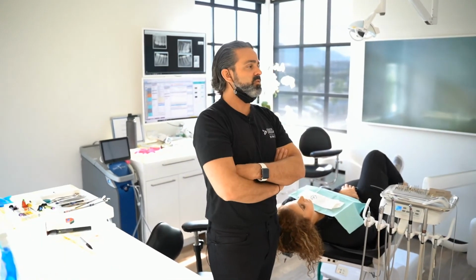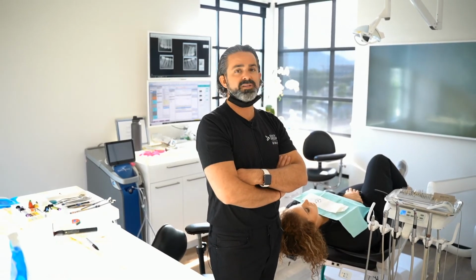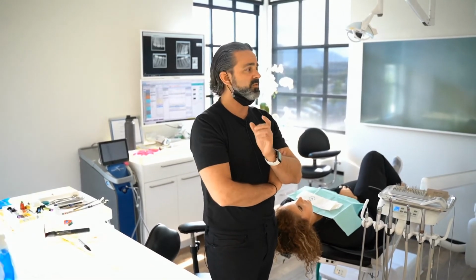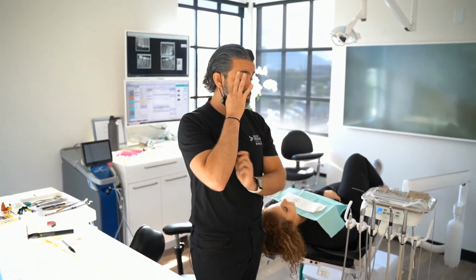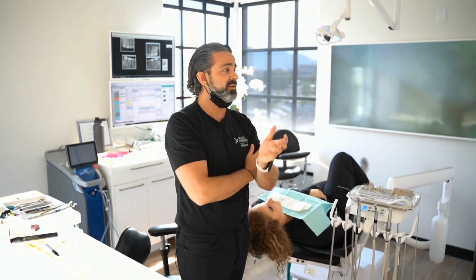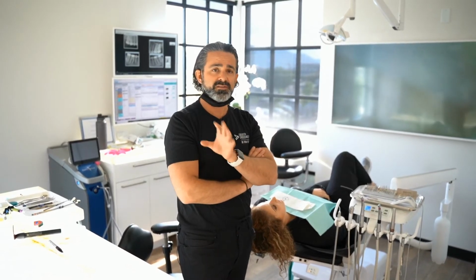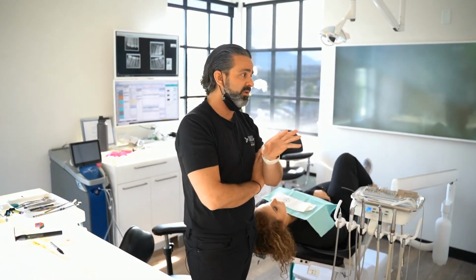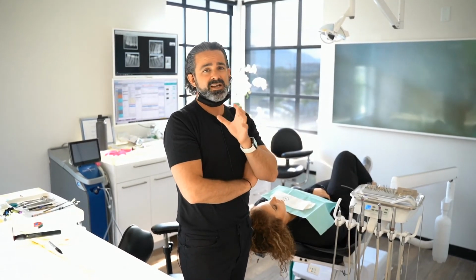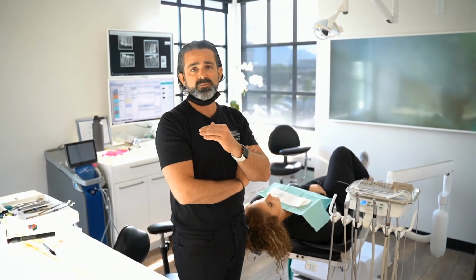How many years have you been using the microscope? Have you been using it the whole time you've been an endodontist? Yeah, so in dental school, when we were in the sim clinic, I bought a pair of loupes as a freshman and went through 4 years of dental school with loupes. When I was doing my rotation in endodontics, we had microscopes. That was something I was just attracted to. It just made sense for me, and I pushed really hard to standardize that at my dental school. When I was a resident, microscopes went all the way across the room in all the endo rooms, which is what happened. And so as an endodontist, I was trained in residency under a microscope and then my whole career.